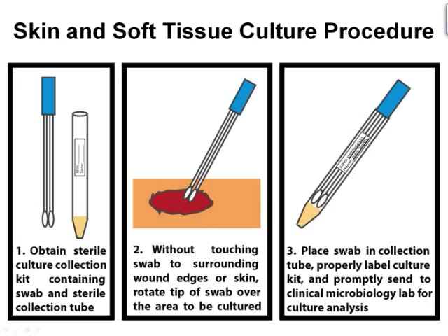A wound that is red, painful, swollen, and draining pus is probably infected, and a skin and soft tissue culture should be performed. The procedure is outlined here. Firstly, the sterile culture collection kit must be obtained. This kit typically contains a swab and a sterile collection tube.